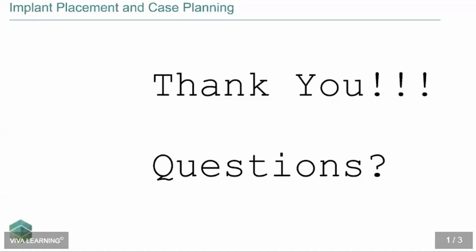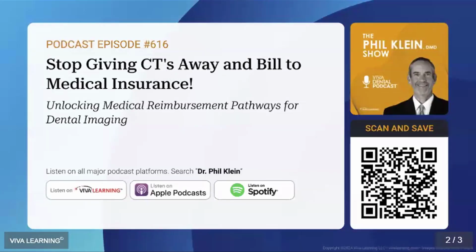Okay, so I had a question: is the conical connection with the implant body related to the emergence profile, or is the emergence profile more in relation to the shape of the implant crown? That's a great question. The conical connection is not so much important when it comes to emergence profile. Any connection is going to give you a particular emergence profile. The conical connection is more ideal when it comes to wicking properties. However, the emergence profile is more related to the platform width.